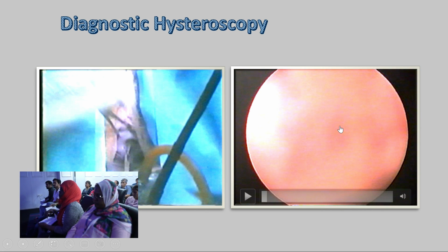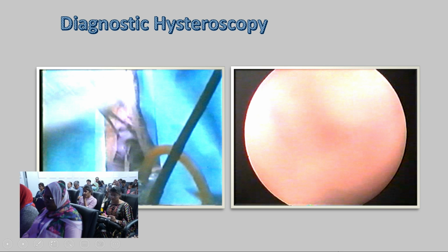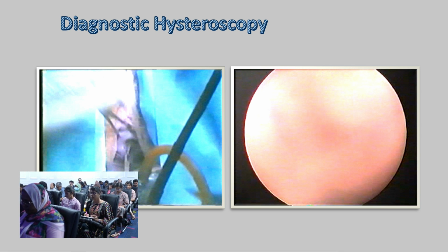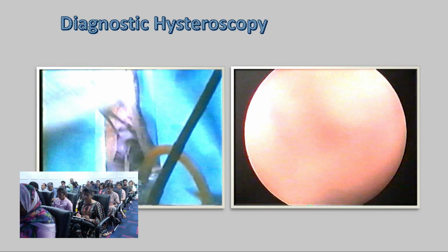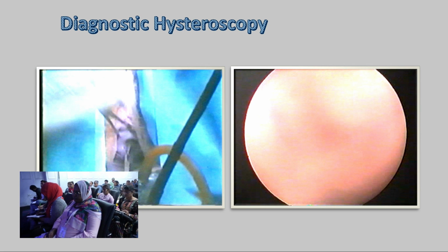After that you put your fluid tip and put the hysteroscope at the tip. Remember, never ever attach the input in the output channel. If accidentally I attach the input here in the outer channel, then fluid will start going by the side. Am I right? And after that you are in big trouble.